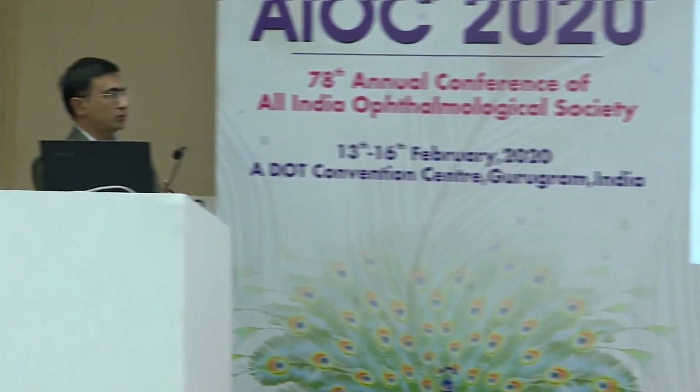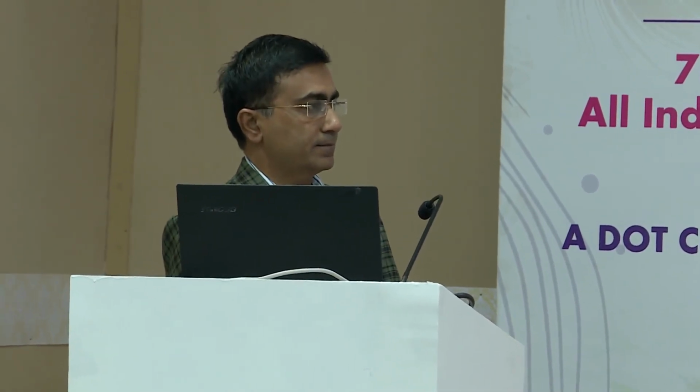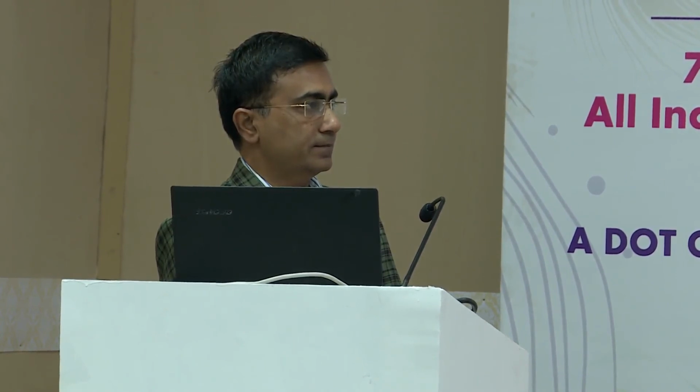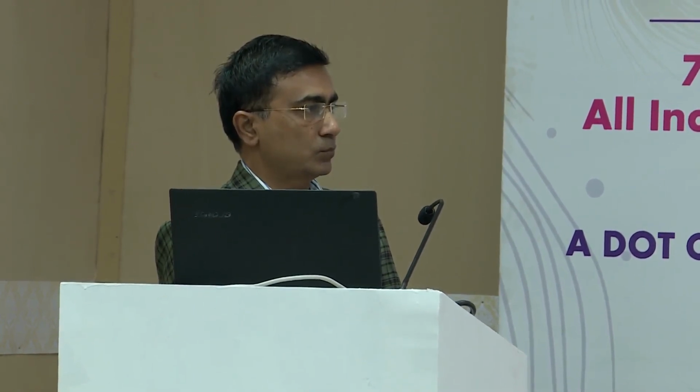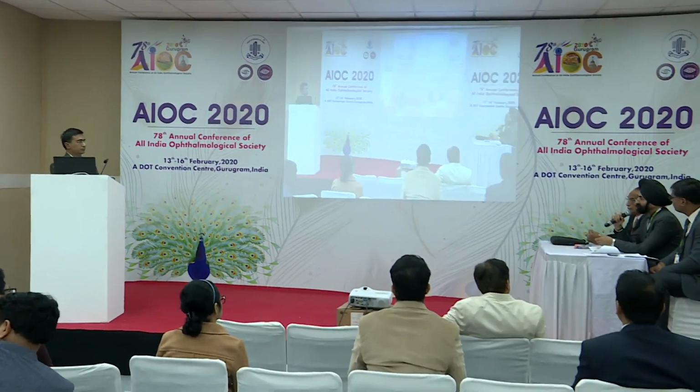Yeah, this could be the possibility, but being a prospective observational study, we could not. From the records, you can go back and check what the axial length was. Maybe this is occurring in eyes with a smaller axial length where the capsular bag may be a little smaller, and that is why you are getting molding, because it's not very common to see buckling post-op. So maybe eyes with a smaller bag could be one of the reasons. Yeah, lesser axial length, lesser white-to-white diameter maybe.